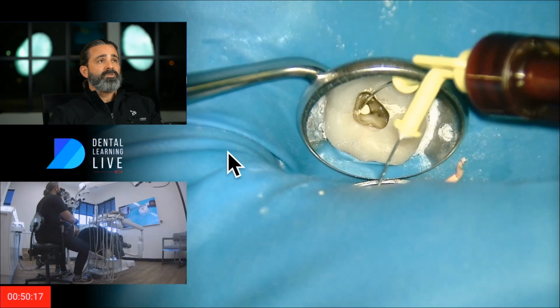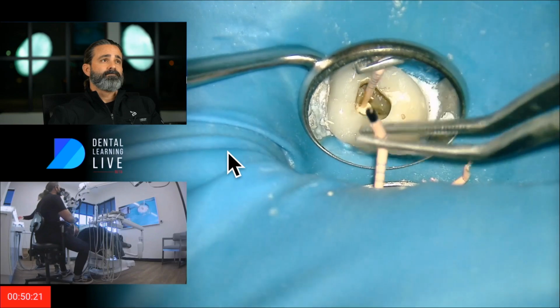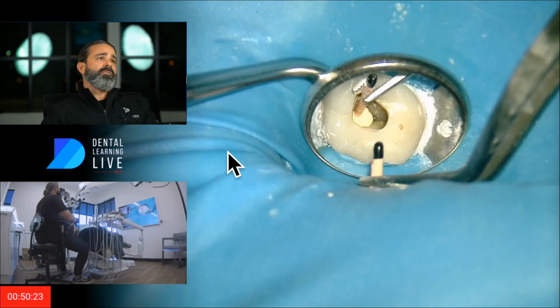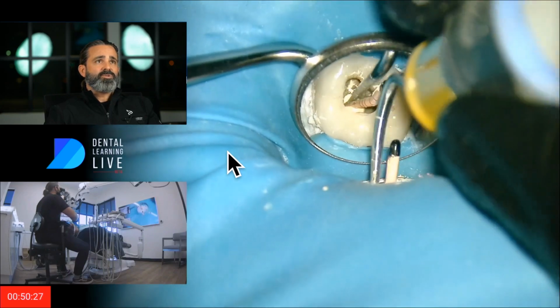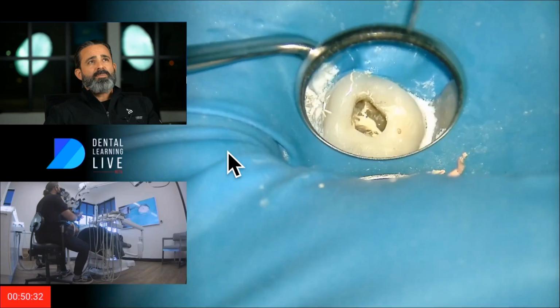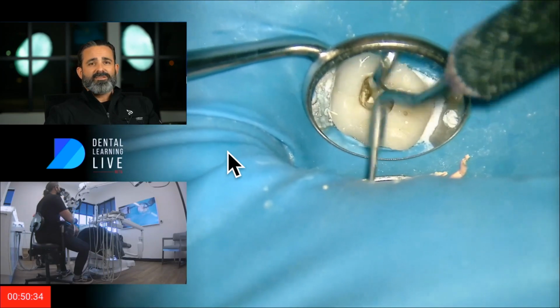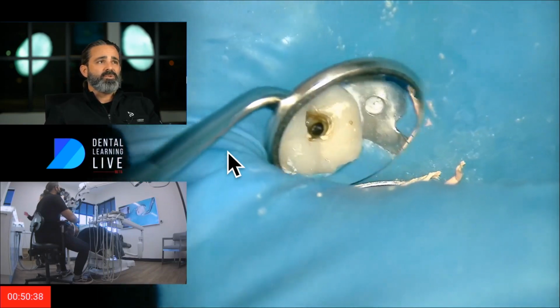Okay, now I'm off to the DB. The technique of obturation to me is, I'm kind of developing this little subculture of obturation techniques based upon the size. When I'm in a retreatment, it's greater taper, 06 or greater, and they're big spaces in these retreatments.